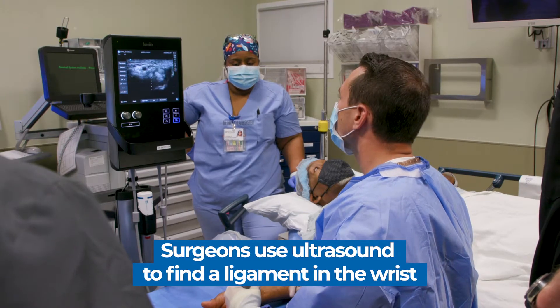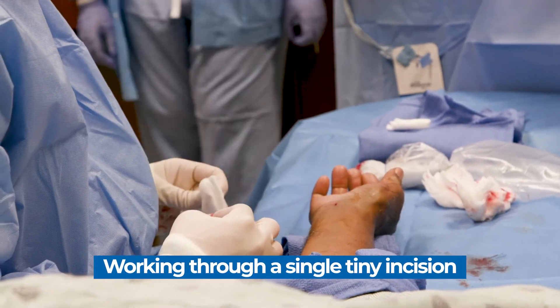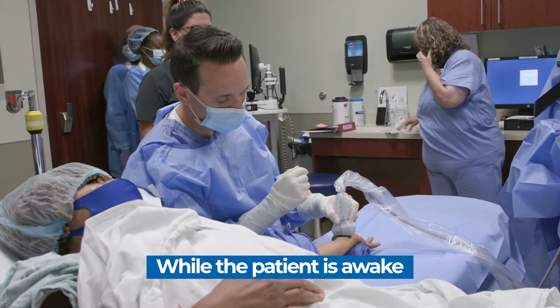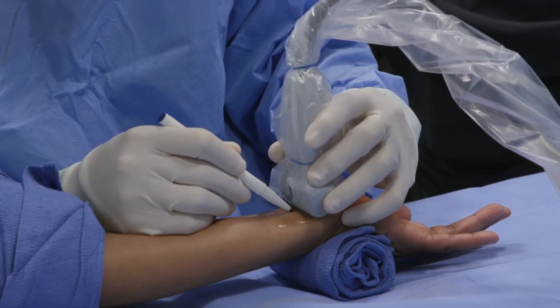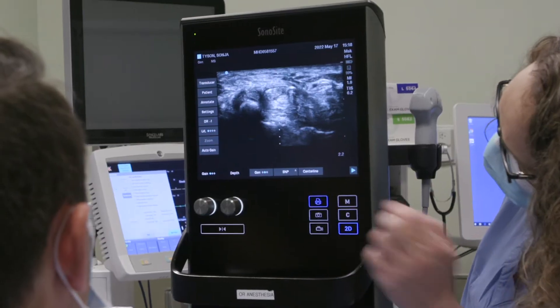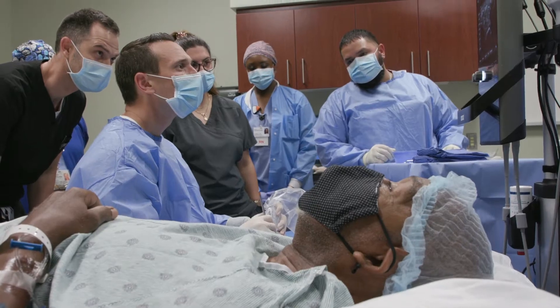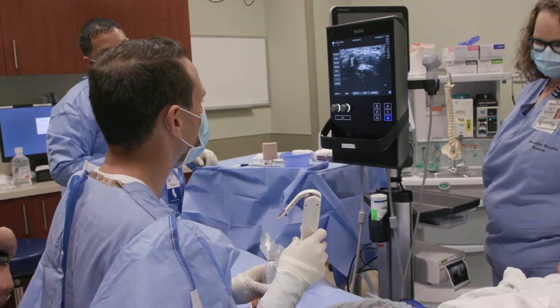When you do our job well, you won't feel much at all. You'll feel some pushing and pulling, but it shouldn't be painful. We use an ultrasound to visualize the anatomy in the wrist to be able to release the carpal ligament, which is trapping the nerves. We're able to see vessels, nerve, tendon, and tissue, and that guides us in to do what we need to do.